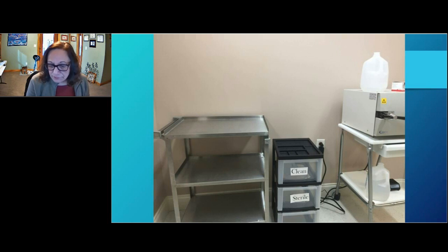Now, the reason I'm hesitating is I look at this little storage cabinet. I'll give you a Lucyism. This is not in the guidelines anywhere. The guidelines say items should be stored 8 inches off the floor, so that whoever's mopping can get under it and the floor can be cleaned. Plus you don't have dust and debris kicking up from the floor, potentially contaminating your items.